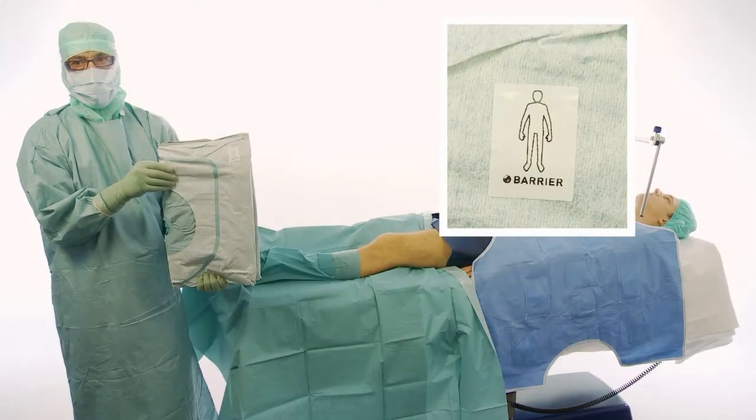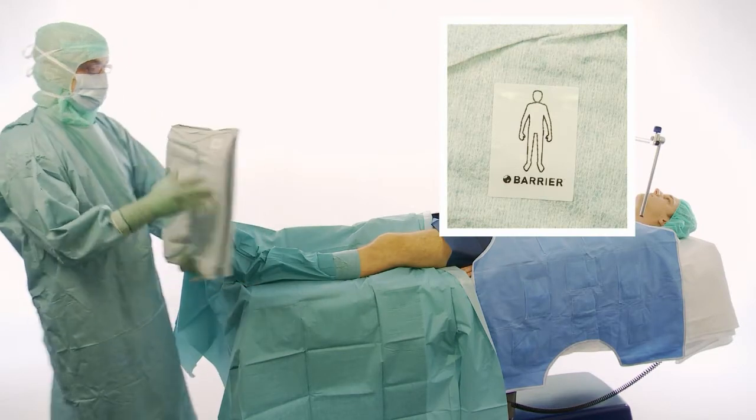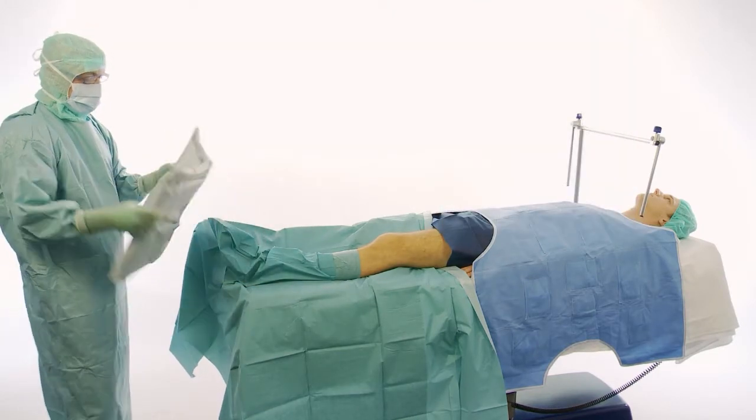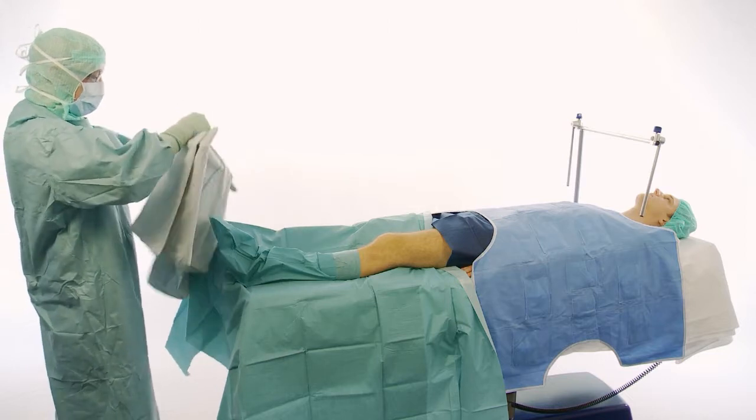Note the direction of the pictogram. Place the unfolded arthroscopy drape over the patient's foot.